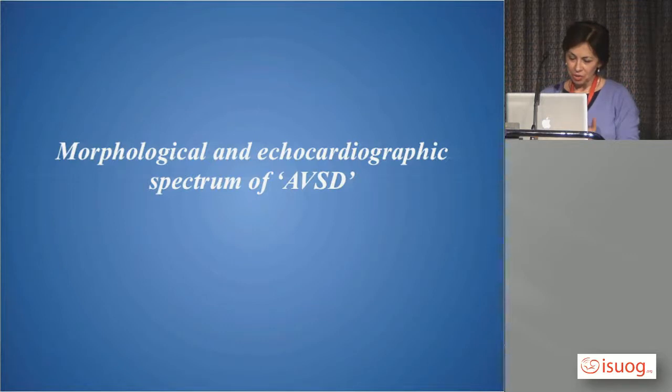So I'm just going to show you a few spectrums and some pitfalls and some points to take home, I think, to hopefully not to miss atrioventricular septal defects. Being a cardiologist, you would be surprised to see how many babies are still born alive with an atrioventricular septal defect. It's huge, the number of children born with atrioventricular septal defect and Down syndrome, escaping all sorts of screening.